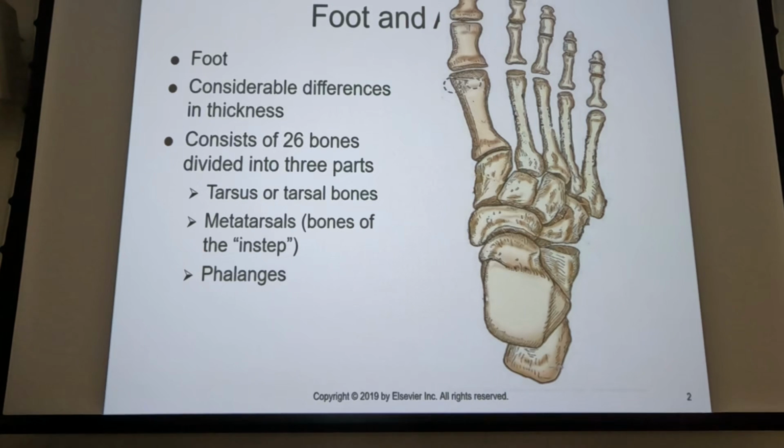Does that kind of make sense? The proximal end of the foot was thicker, so it absorbed more x-rays, fewer got to the image receptor, and it would even out the tissue density differences between the two ends of the foot.